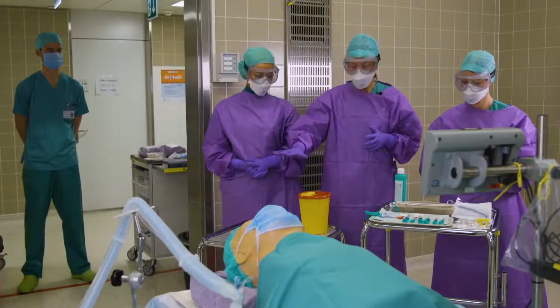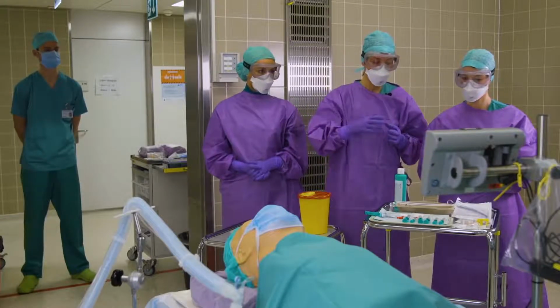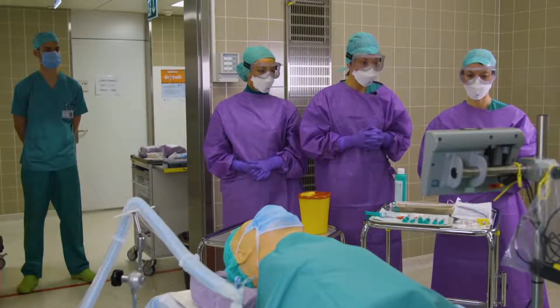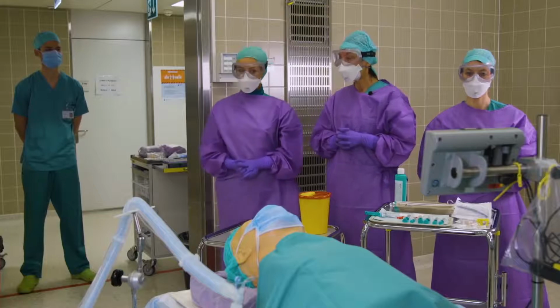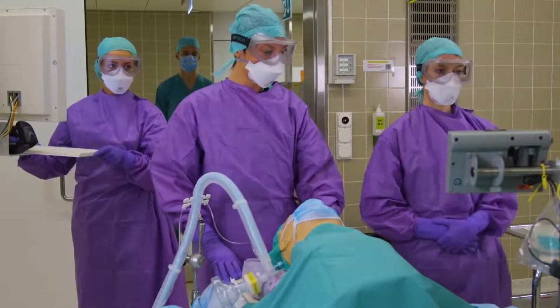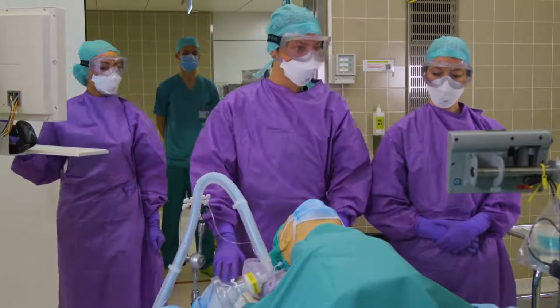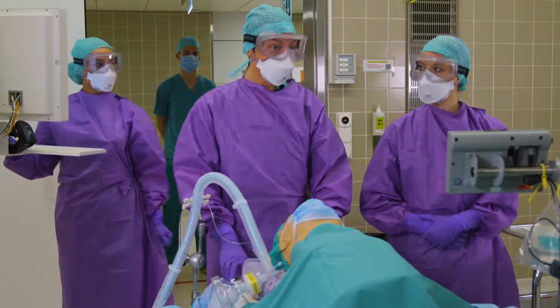It's also important to have a trash bin next to the patient so you can drop dirty articles right into the trash bin. Outside we have Tim, who is our clean person and jumper. In case we need medications or airway material, he will be able to hand them to us. We designated our roles clearly, with Larissa being the medication person and airway help, Manila doing the documentation, Tim outside as a clean person, and myself as a seasoned anesthesiologist doing the airway.